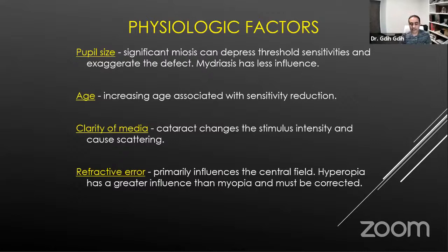Now, the newer Humphrey visual field machines, like the Analyzer 3, nowadays have a built-in lens, so you don't have to bring a trial lens. It's about $8,000 more to pay for that lens, but it will change the power of that lens. I believe it's an air-filled or water-filled lens. I don't have it, but it's quite unique to see.